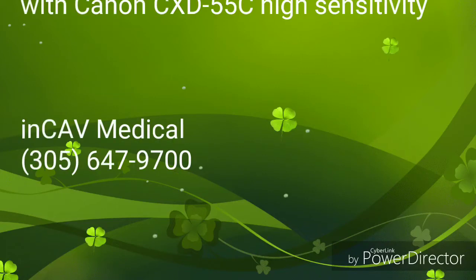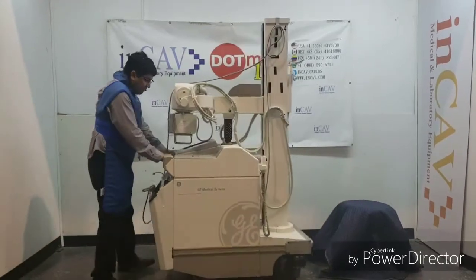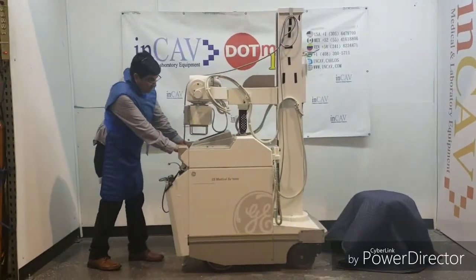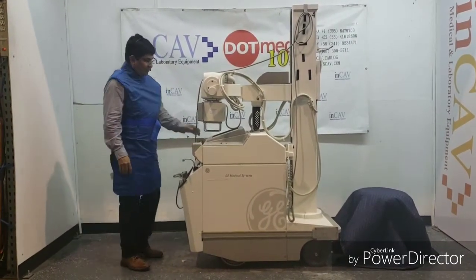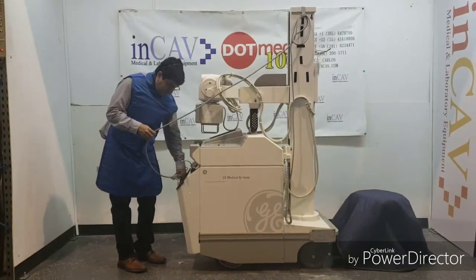This is the AMX4, the AMX4 DR — the digital version of the AMX4. It's a very versatile and powerful machine, very friendly to use. You can use it like a regular AMX4.